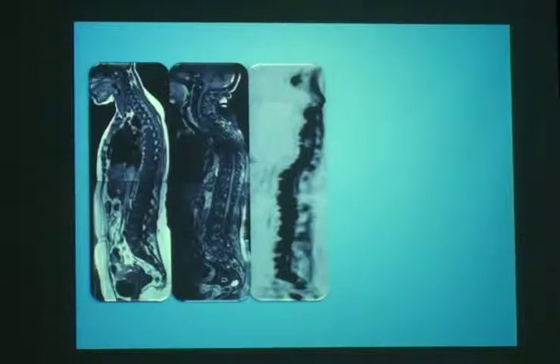But actually, this patient had a yellow to red marrow reconversion. She had dense red marrow because she had chronic anemia. Now, this is one of the pitfalls of MRI. The issue here is that you are either going to call this a diffuse infiltrative process, diffuse metastasis, or myelomatous affection, or a benign entity as a red marrow. In this setting, you definitely can't call it with confidence either way.